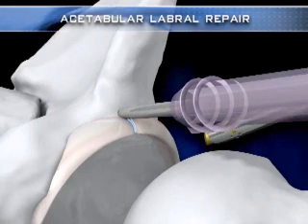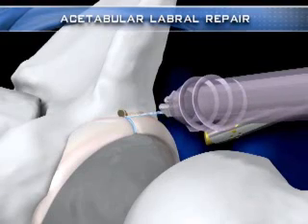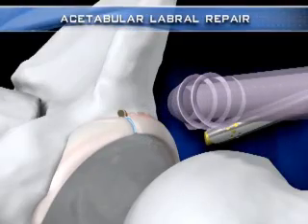The pushlock handle is removed by turning it clockwise 6 full revolutions while gently pulling back. The remaining suture tails are clipped using a suture cutter. Multiple pushlock anchors can be placed in the acetabulum according to the size of the defect.